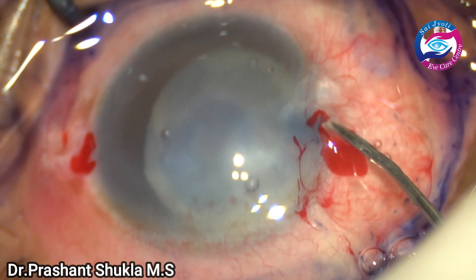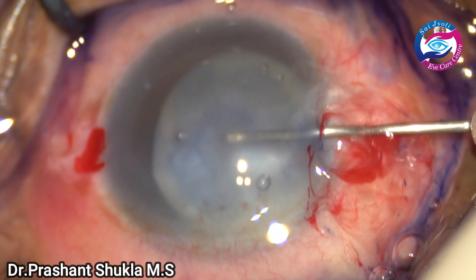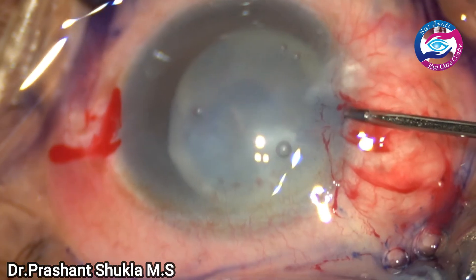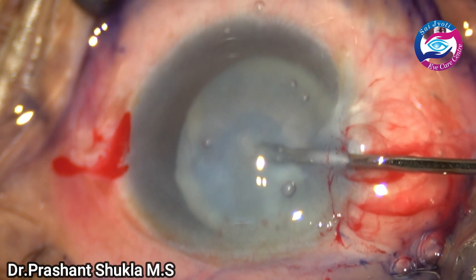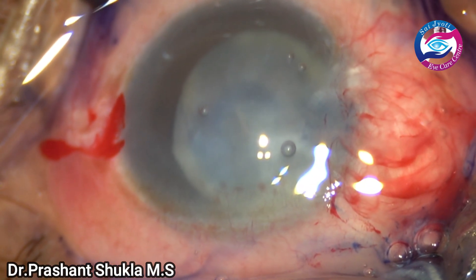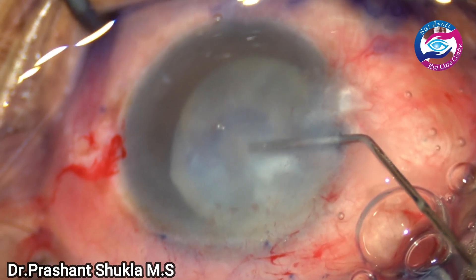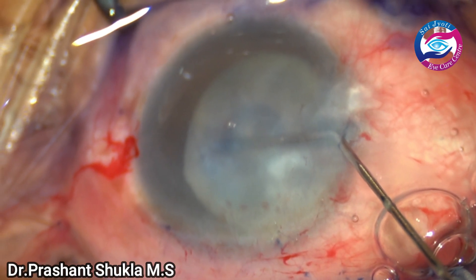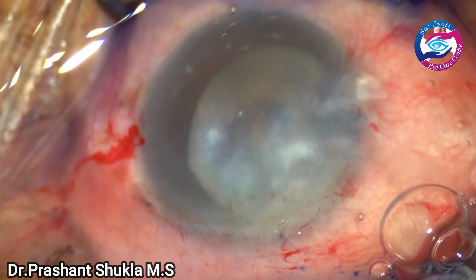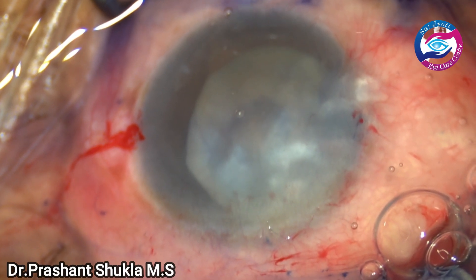Due to the intumescent nature of the cataract, I have planned to do a two-stage rhexis. I am using a bent needle cystotome just to puncture the anterior capsule, and one can see there is a gush of white milky fluid into the anterior chamber. The visibility is not very great because the status of the cornea is also not very good — the pressures were high for a substantial time. I am using a 27-gauge cannula just to release out some of the trapped fluid inside the lens.